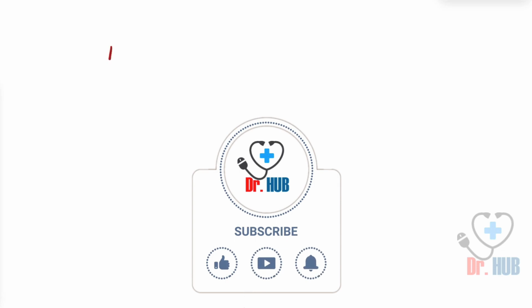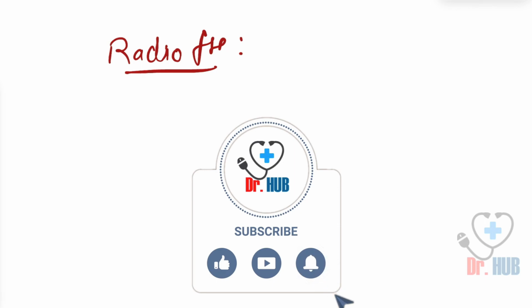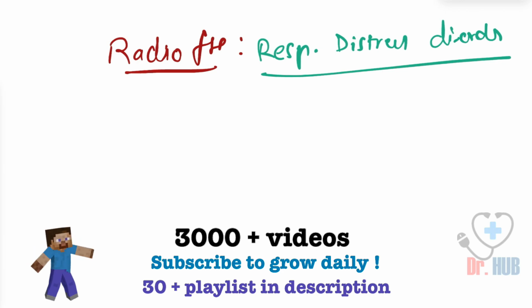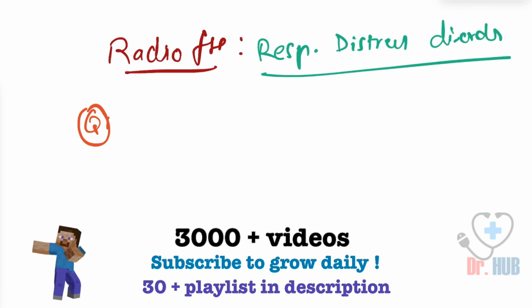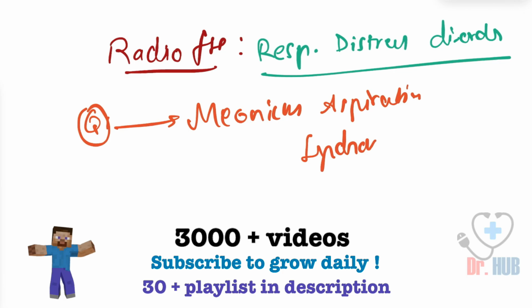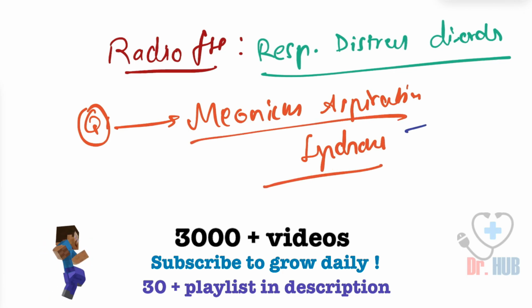We are going to look at the radiological features of the major respiratory distress disorders. To begin with some questions, the first question is, in case of the meconium aspiration syndrome, what are the findings? So in this video, we'll find out this answer as well as learn in detail.